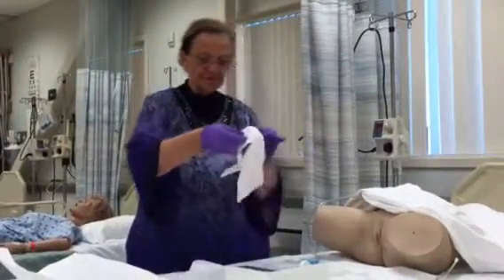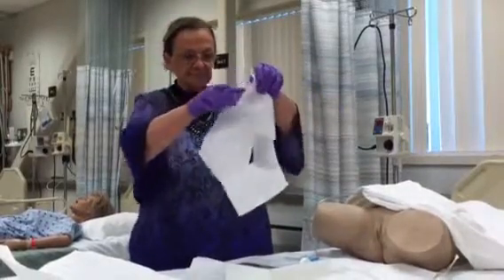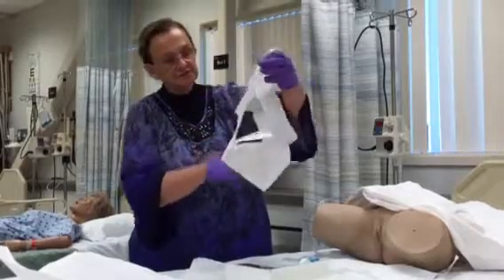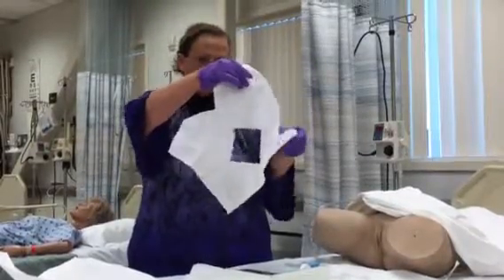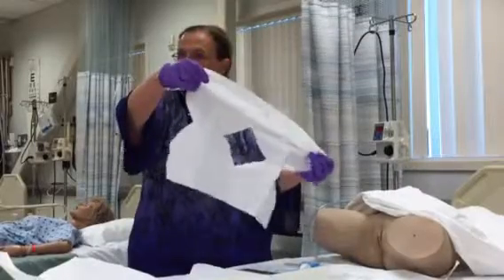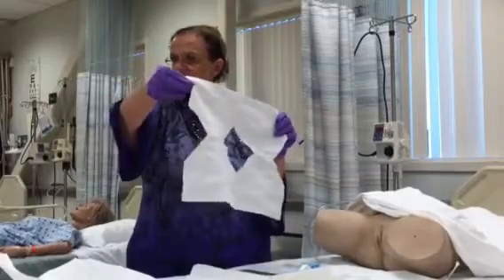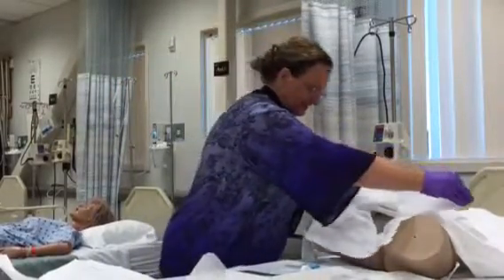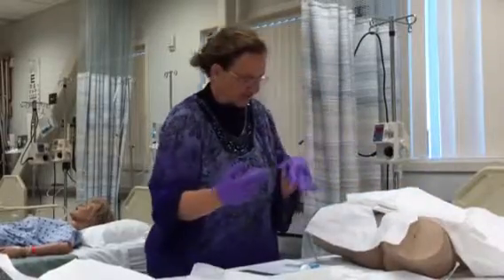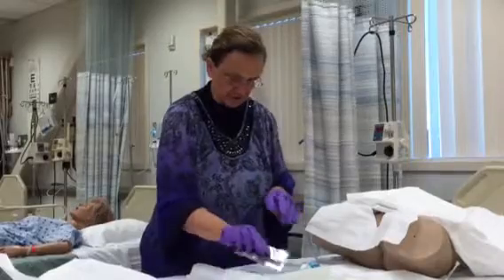This happens to be another drape. It can be used. I sometimes find them a little clumsy to use, and I personally prefer not to, because I don't like to have it fall down, but I will go ahead and attempt to use it today just for you, all right? But if it falls out of my way, I'm going to have trouble getting where I need to go.